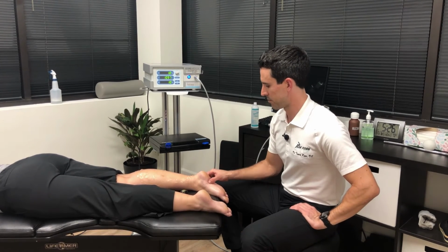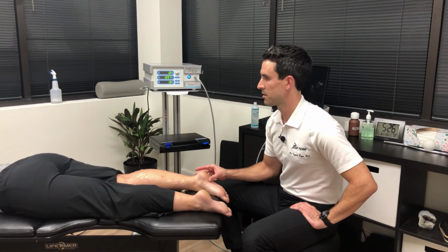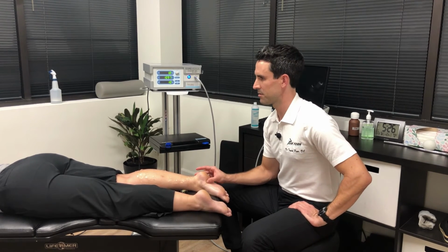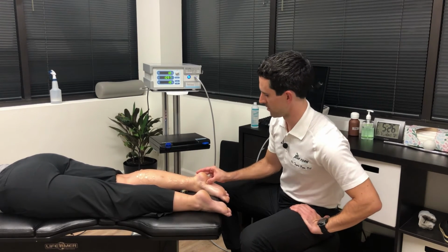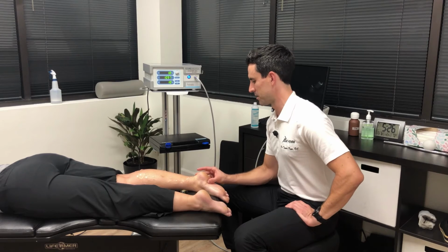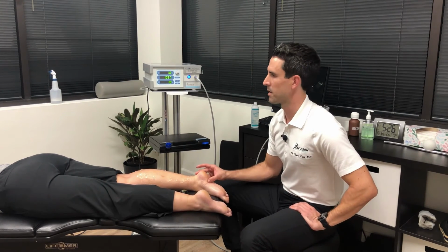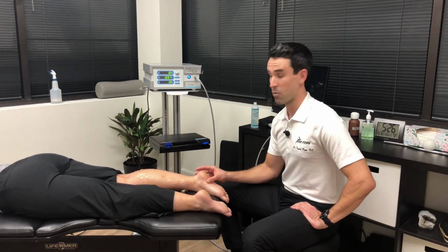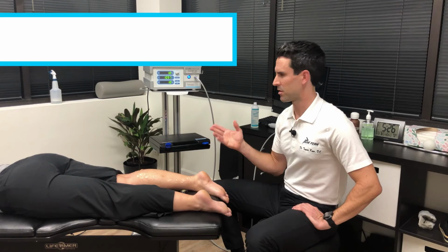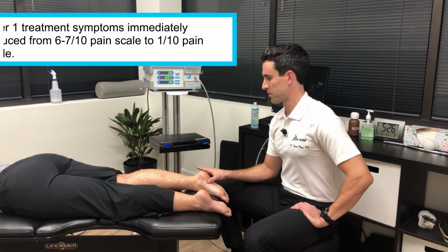Now I just want to see how we did with the treatment. Sarah, how's that feel as I push into the tissues? A lot better. Is it still a little sensitive? Maybe just a tiny bit on the outside there. But overall, and I'm pushing much more firmly into the tissues than when we first started. So give it a number, 0 from 10. How painful is this right now as I'm pushing in? 1. Okay, so 1 out of 10. We started, it was more, I think you said 6 to 7 out of 10. Yeah. So substantial improvement just after the first visit.